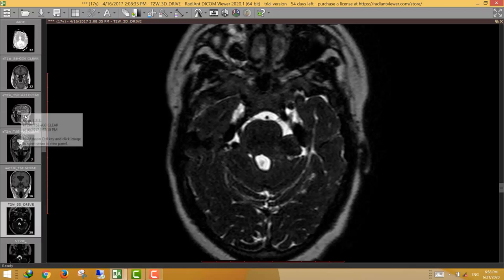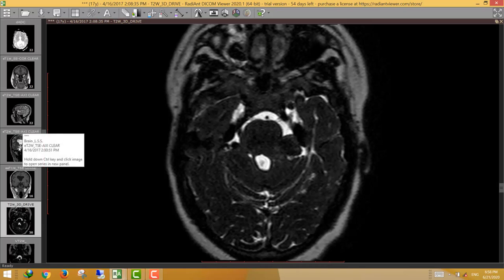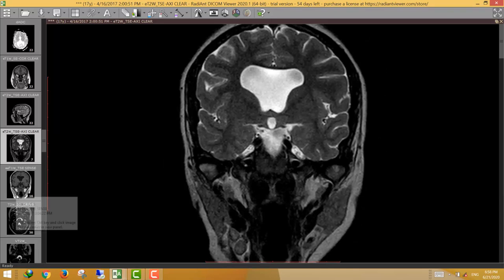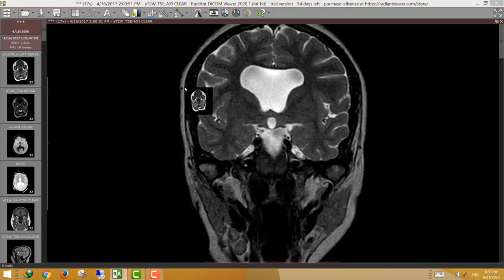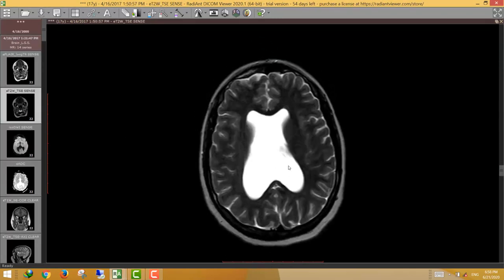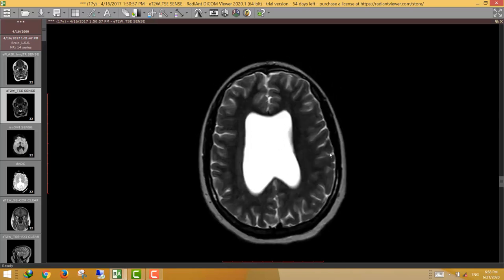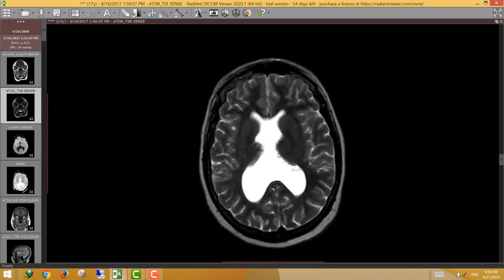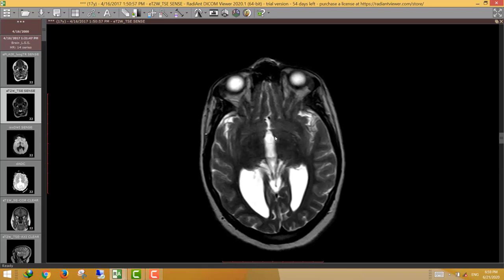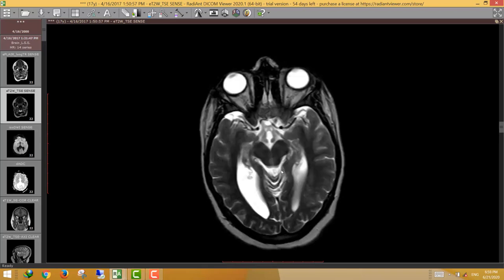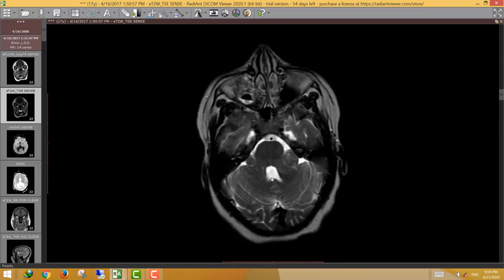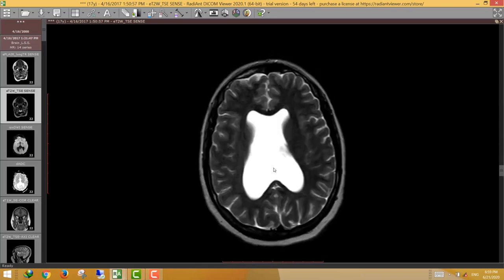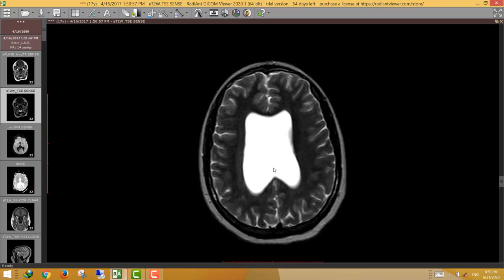In this patient, there are two additional findings. First, there are hydrocephalic changes — dilatation of the lateral ventricles out of proportion to the extra-axial spaces, with dilatation of the third ventricle and also the fourth ventricle. This is a communicating type of hydrocephalus, with no definite site of obstruction.